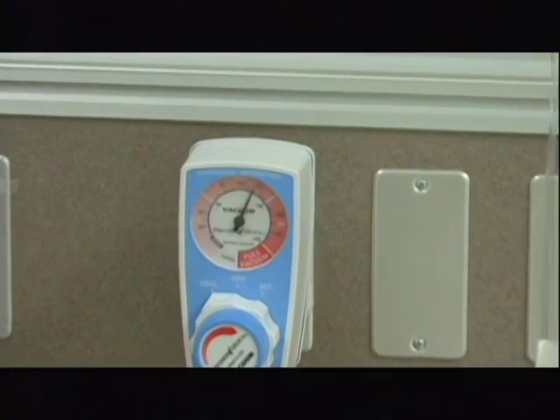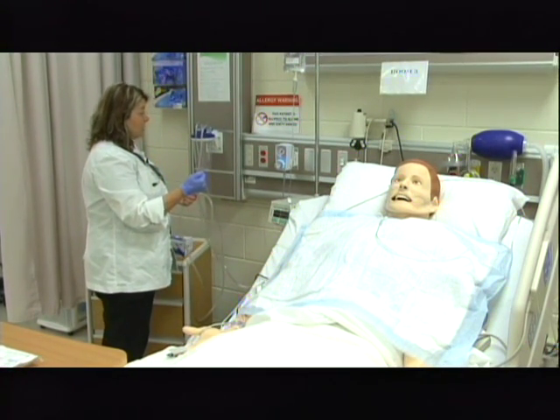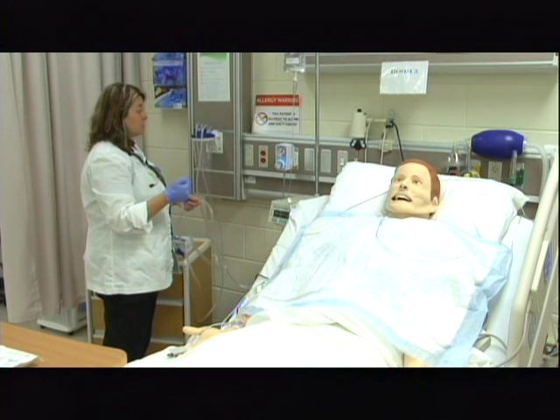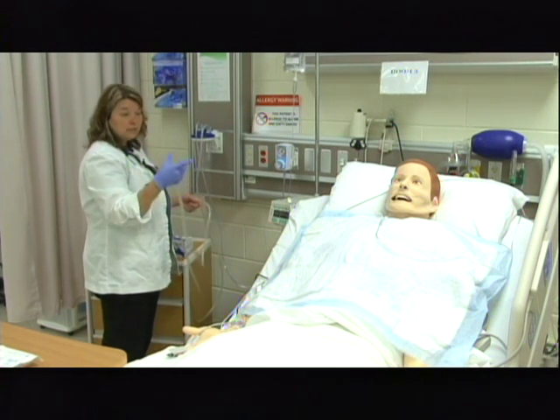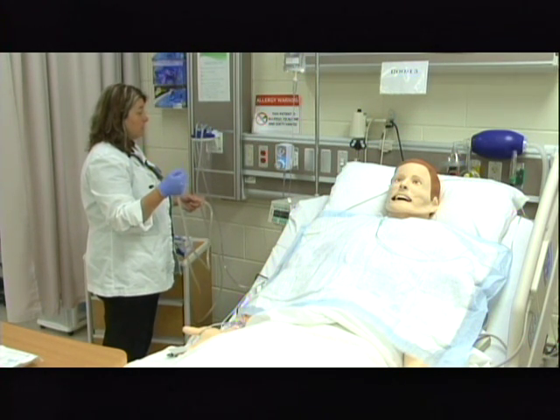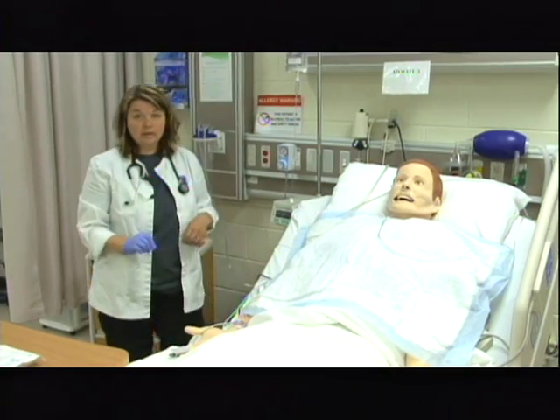Once I have the suction set between 100 to 150 millimeters of mercury, I'm going to take my clean gloved hand and occlude it, making sure that it does not go over 150 millimeters of mercury when occluding. I'm not going to suction for more than 10 seconds, occluding it intermittently and tapping it so I can check that it does not go over. It is now at the appropriate suction. I'm going to lay this beside my patient on the bed so I can reach it.